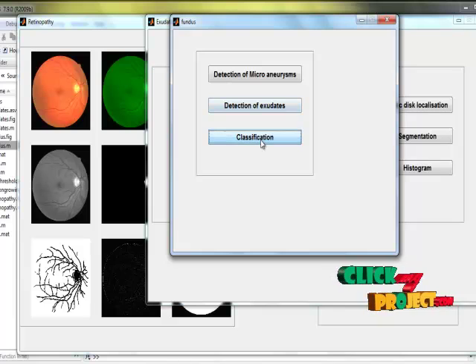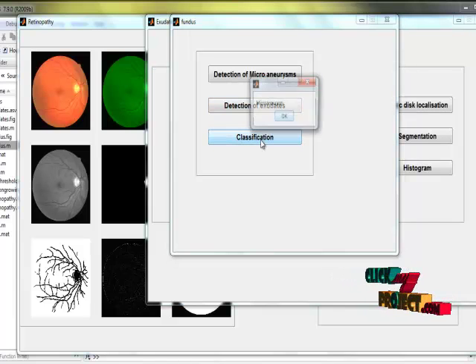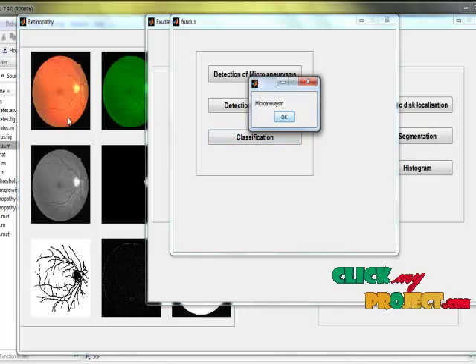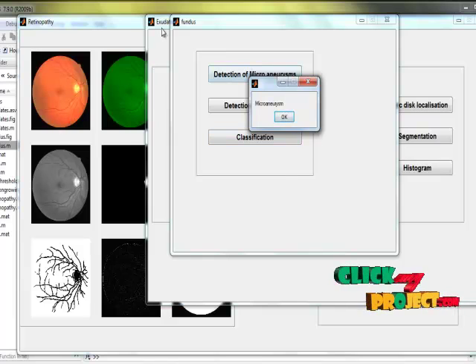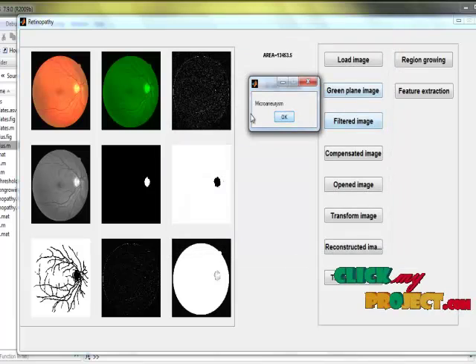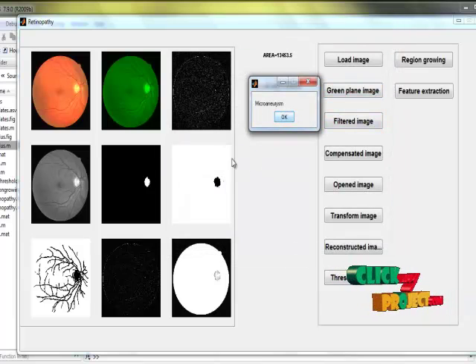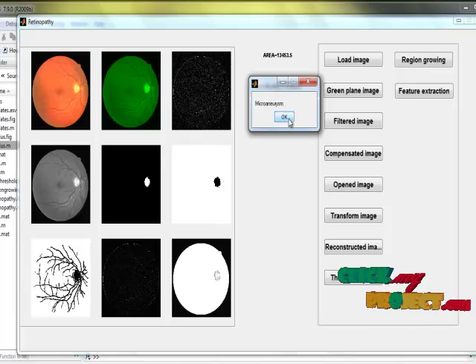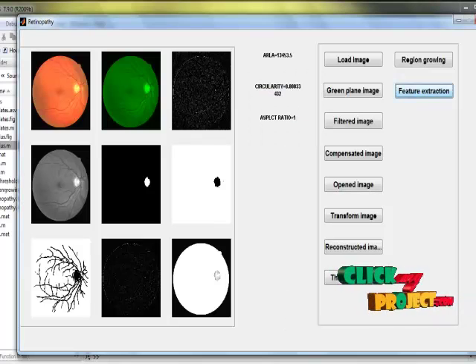We are moving to classification — whether it is exudate or microaneurysm. For this process, the image is classified as microaneurysm.